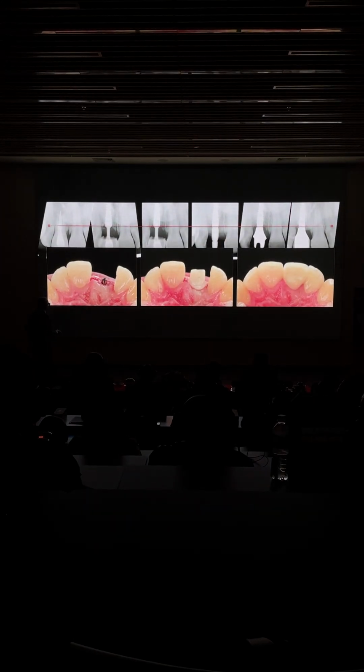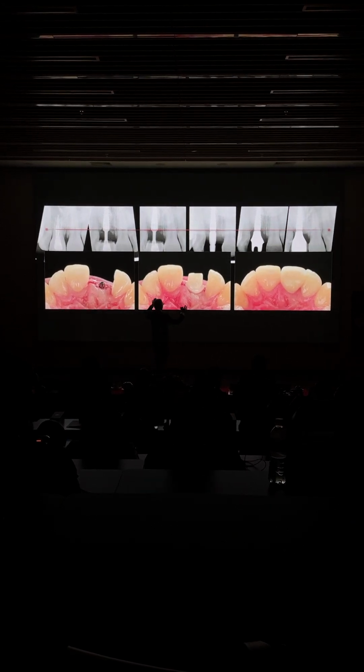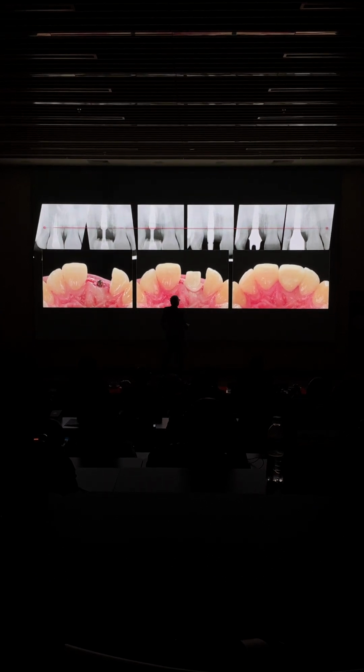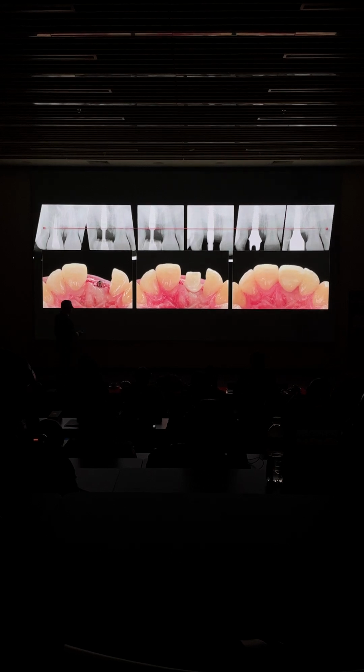You can see that the depth here, my implant is way too crestal, it's not deep enough, and that they have a craterization because of that weak bone that I grafted. So you can see this is a beautiful shot about what I was discussing. The tissue will recede vertically and horizontally towards the center. And you will see, you have to rely on it, you will see how the tissue will creep back. It takes around 3 months to see that and to have a perfect result.